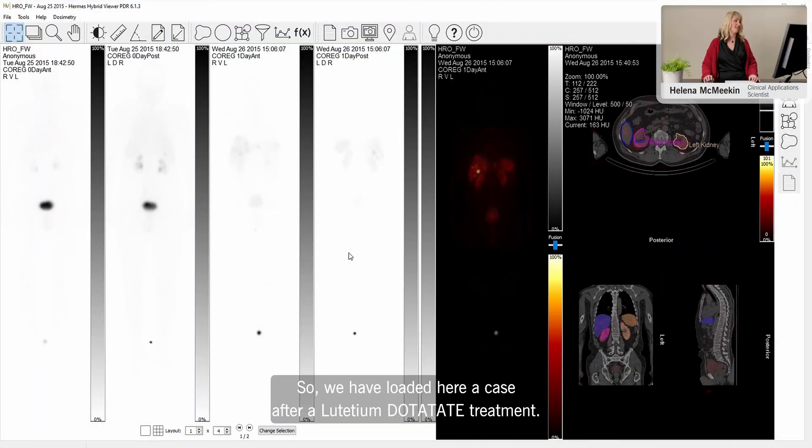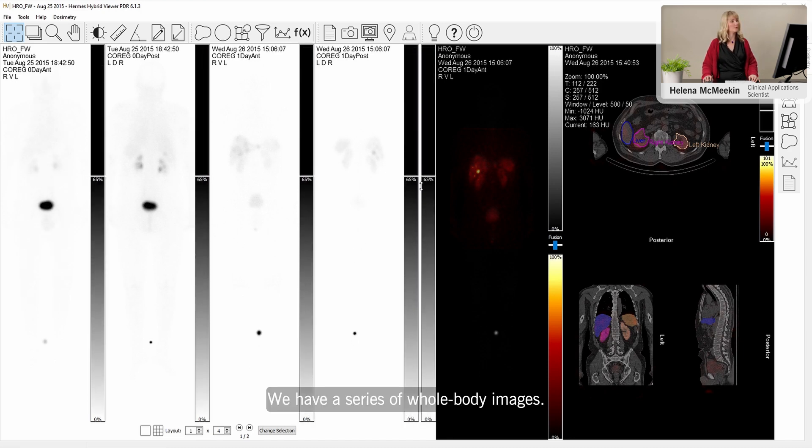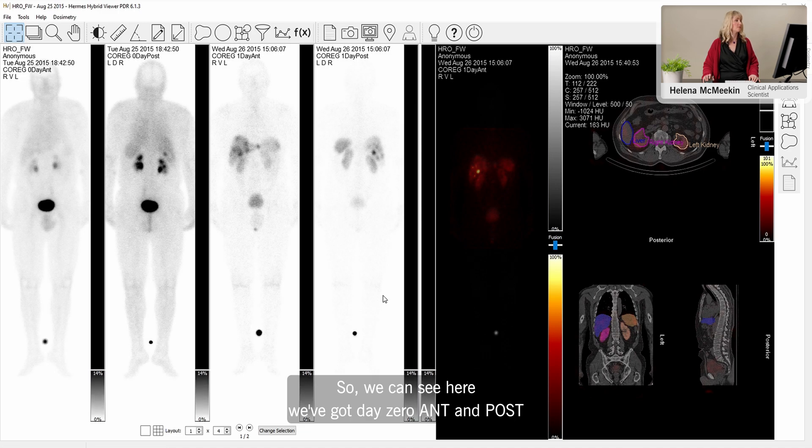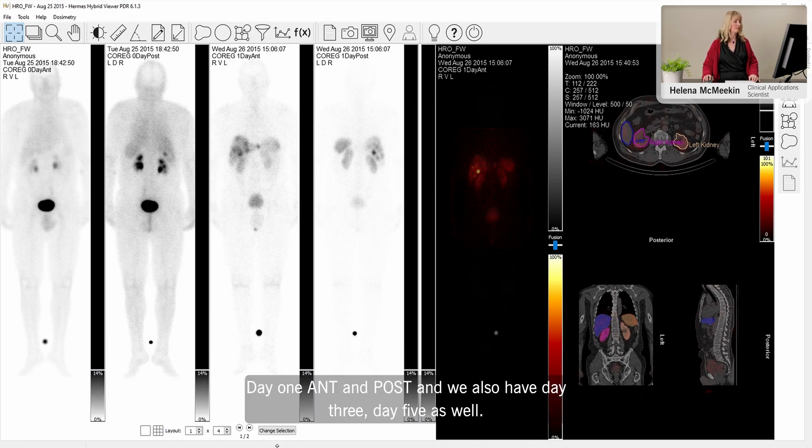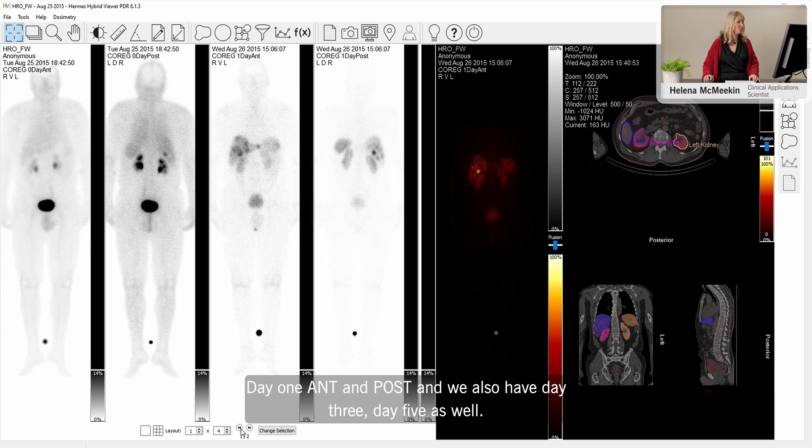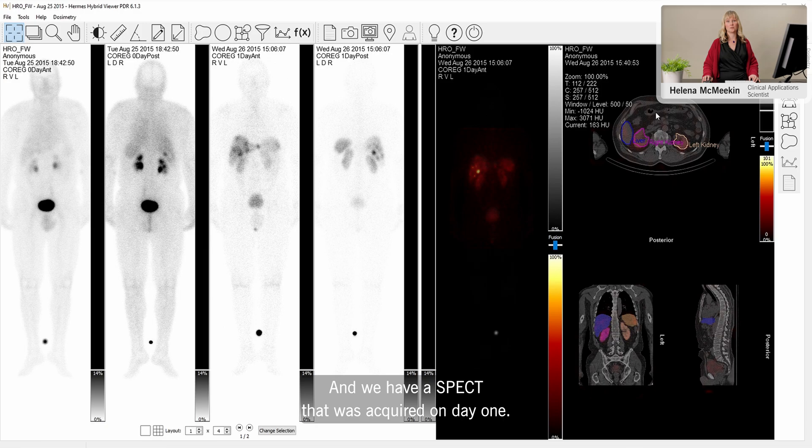We have loaded here a case after a lutetium dotatate treatment. We have a series of whole body images. We've got day 0 anterior and posterior, day 1 anterior and posterior, and we also have day 3 and day 5 as well. And we have a SPECT that was acquired on day 1.